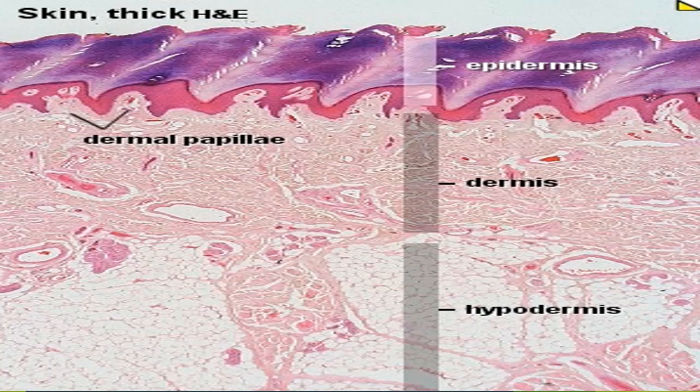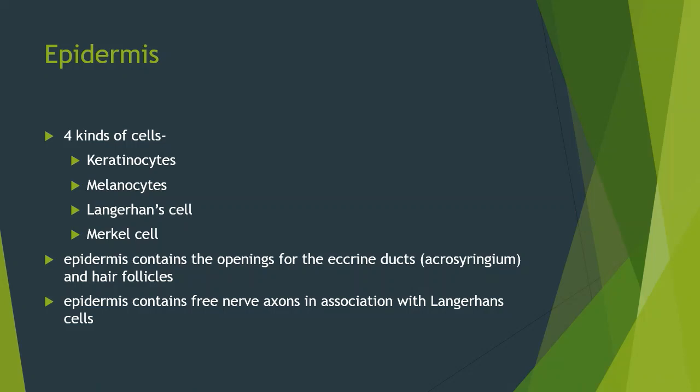If we look at the basic histology of skin, it comprises three parts, as I previously mentioned. The most superficial part is the stratified squamous epithelium with a thick keratin layer over it, which is the epidermis. Below it, there is the fibrocollagenous area with some vascular structures, and there may be some smooth muscle and skin adnexal structures, which is the dermis. Below the dermis, there is the hypodermis, where there are lobulated mature adipocytes with some fibrovascular septa. We will come to them gradually, one after another.